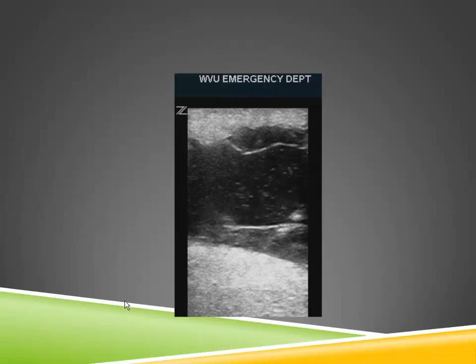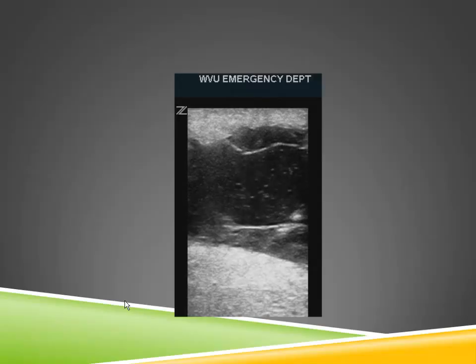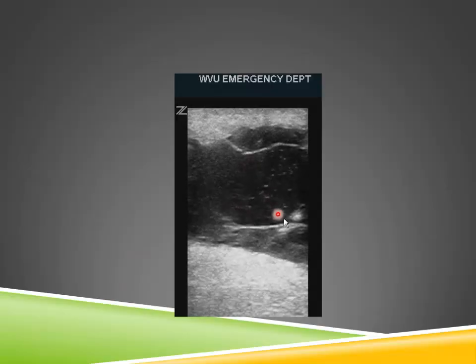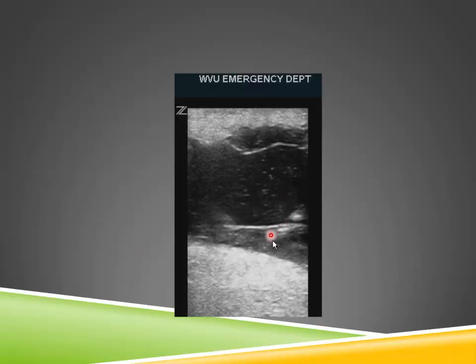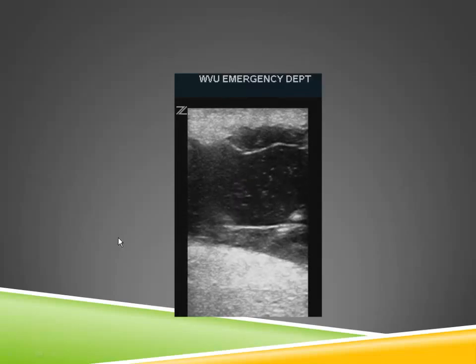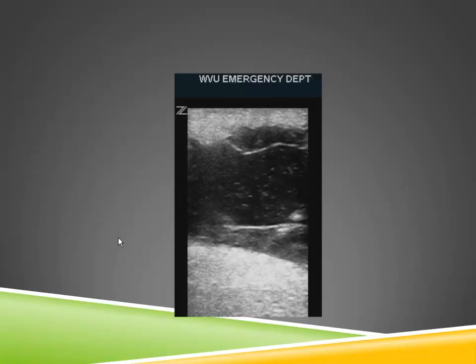And then sometimes you might see something that I affectionately refer to as pussistalsis. I can't claim that I made that word up, but I like it, where if you push a little bit, you'll get the pus inside this abscess to swirl a little bit. Peristalsis can look a little bit like this, but this is an area where we're not really worried about bowel, so that's called pussistalsis, or the swirl sign. But that's another piece of evidence for pus inside of a fluid collection.